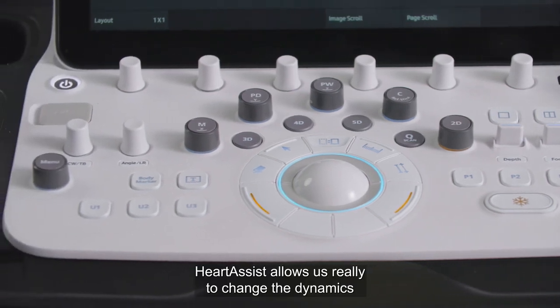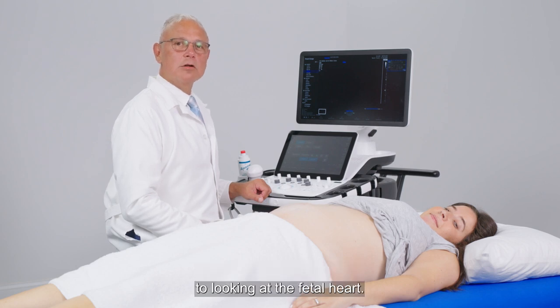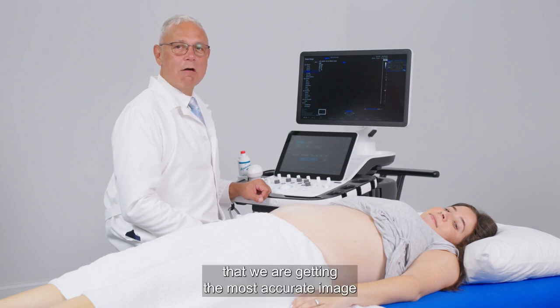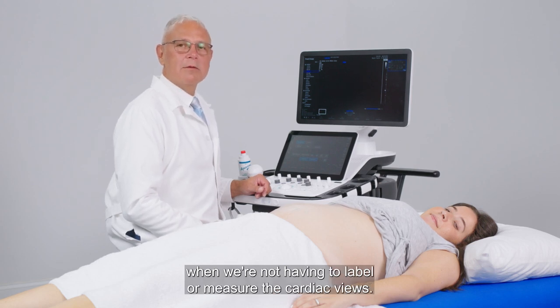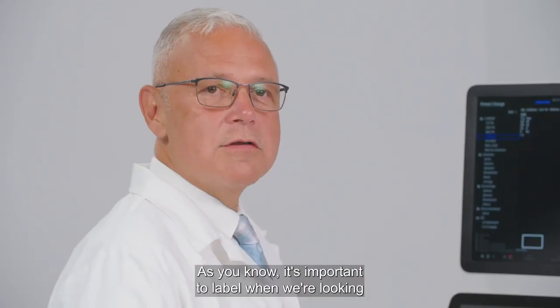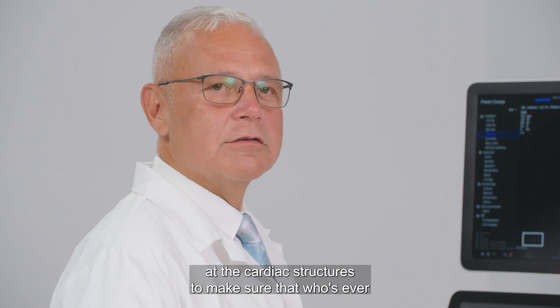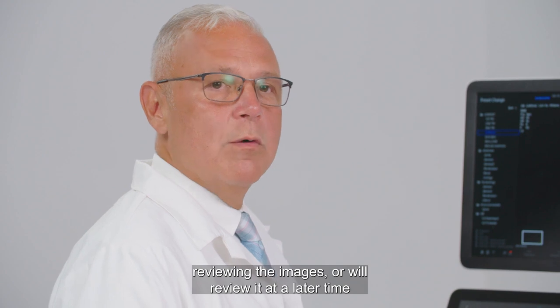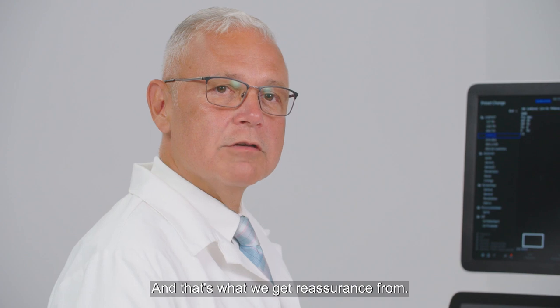HeartAssist allows us really to change the dynamics of our patient interaction, particularly when it comes to looking at the fetal heart. It allows us to make sure that we are getting the most accurate image, which we typically try to do, but also it saves time when we're not having to label or measure the cardiac views. As you know, it's important to label when we're looking at the cardiac structures to make sure that whoever is reviewing the images, or we review it at a later time, we can accurately say, yes, that's what we're looking at, and that's what we get reassurance from.